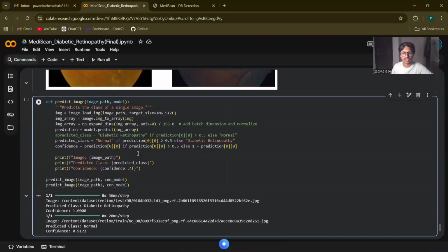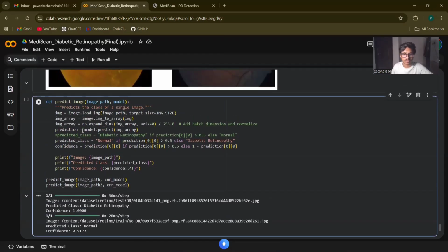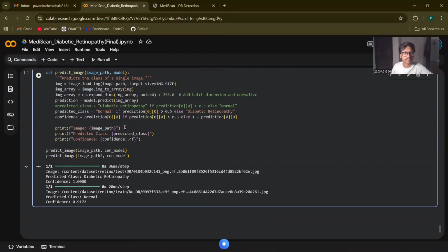This is vital because neural networks require a consistent input size. The image is converted into a NumPy array of pixel intensities from 0 to 255. Then we divide the pixel values by 255, which scales the data down to the range 0.0 to 1.0. This normalization process speeds up training and helps the network learn more effectively. And next, we come to making the prediction. Here, in this line, the prediction is equal to model.predict of the image.